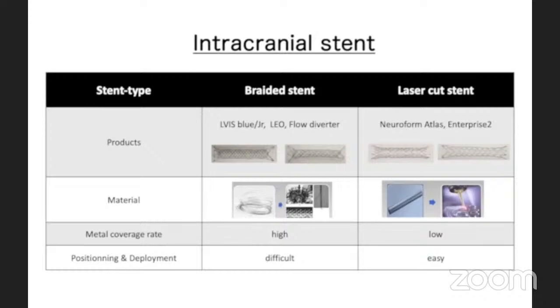A braided stent has higher metal coverage rate, so flow diverting effect can be expected. On the other hand, positioning and deployment of laser cut stent are very easy compared with braided stents. We have to select the best stent in each situation.